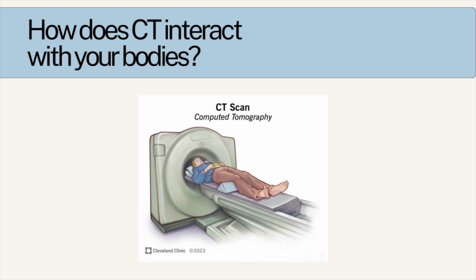In basic terms, the X-ray tube will shoot out the X-ray, and after it shoots out the X-ray, it's gonna go through your body, and this is proportional to the density of your internal organs. Using that density, it's gonna pass through the receivers, and using the computer inside the CT scan, it will create an image of what your internal body pretty much looks like.